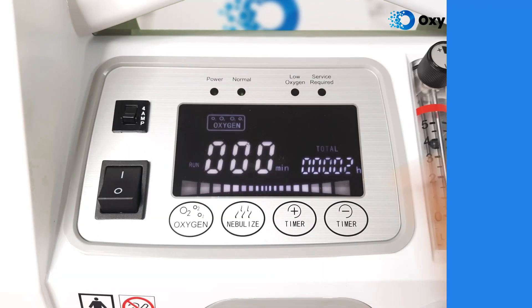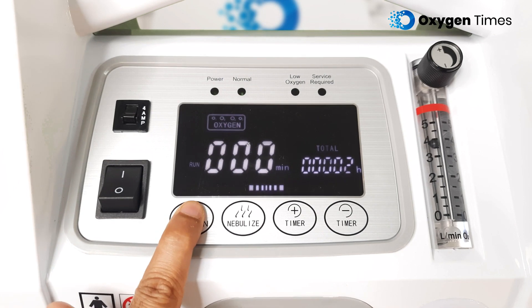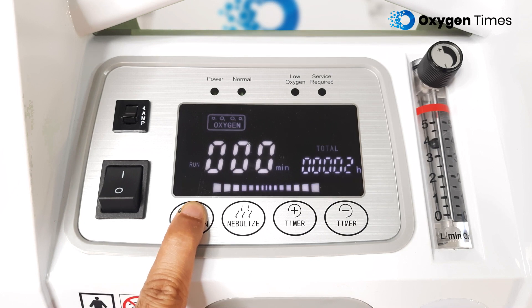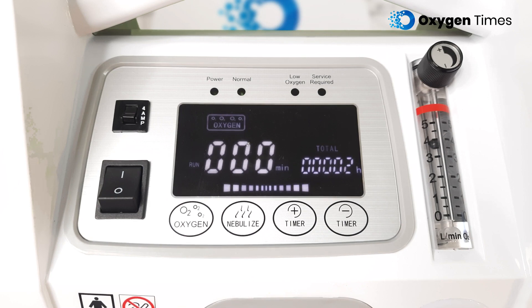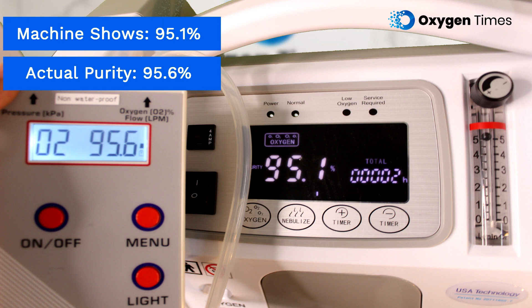The most splendid feature about the Evox 5 LPM is its built-in Oxygen Purity Analyzer, so you can very conveniently view the percentage purity of oxygen being delivered by the machine. Just long press the Oxygen button present on the top of the panel. Whichever flow you have set the device on, the digital display will show the oxygen purity of that flow. We also checked this using our external Oxygen Analyzer and the results are quite impressive — the machine actually provides slightly higher oxygen purity than what is displayed on its screen.